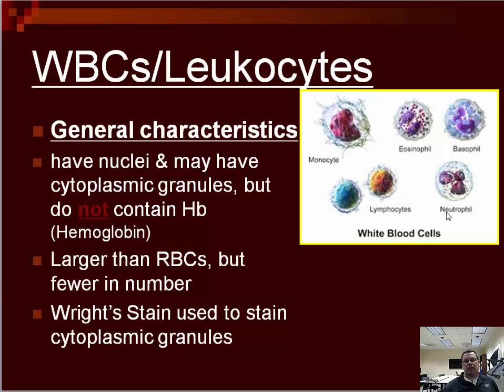These three are fewer in number and take up different colors. On the other side here, you have two lymphocytes side by side and a much larger monocyte. These two cells are agranular in comparison to the other three on the right side of the screen.